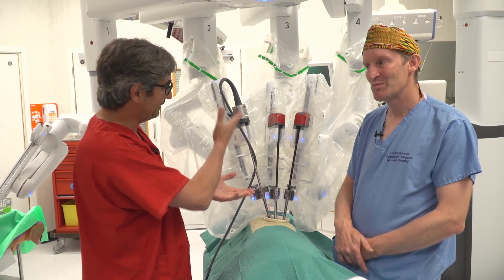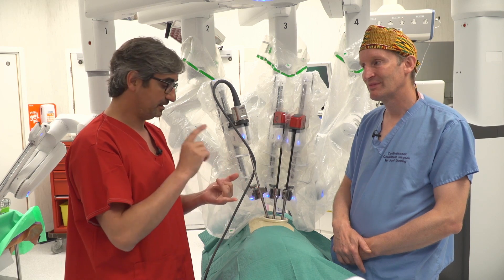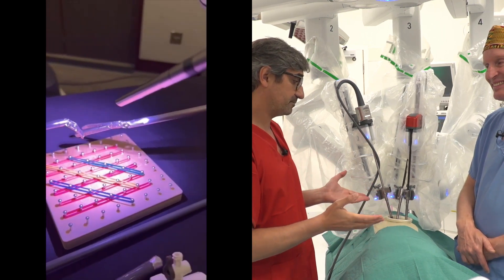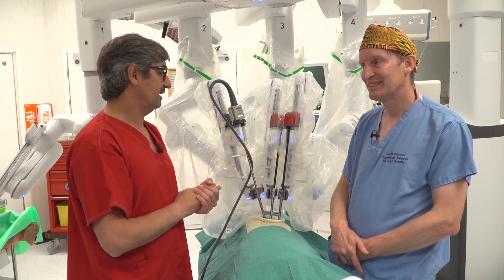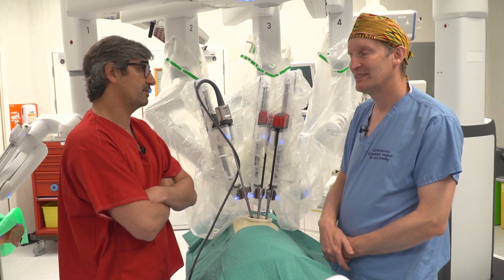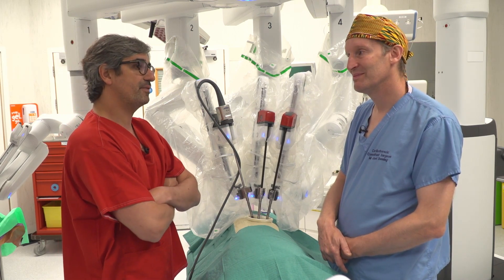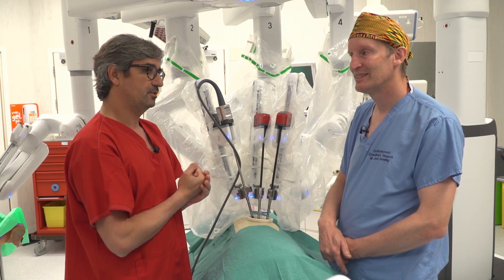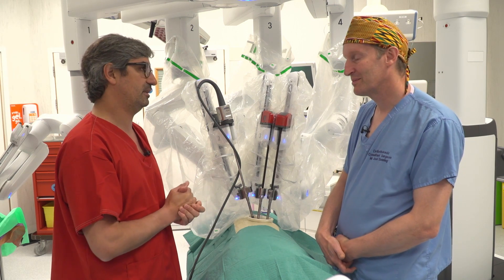We are working very hard to establish the perfect setup to do everything smoothly without any problems. The first thing is to get the proper trocars. We are now waiting for the 8mm staplers — that would be fantastic and give us more space. This kind of video is very useful and illustrative. There is a learning curve in this technique, of course. If you are experienced with RATS it will be much easier to start. If you are experienced with uniportal VATS it will also be much easier. Robotics is quite easy for uniportal VATS surgeons, especially with this view — the camera and instruments in the same direction. You need to be qualified in minimally invasive surgery to jump to uniportal RATS.